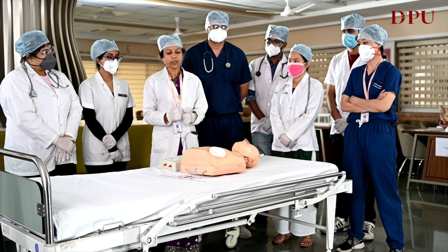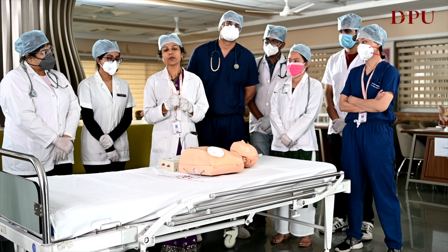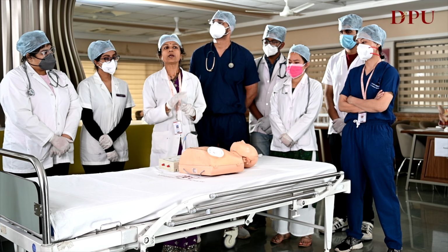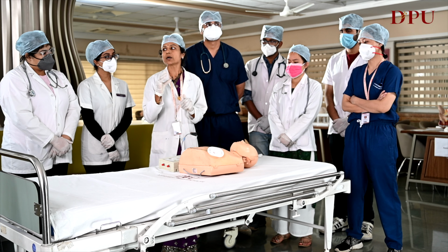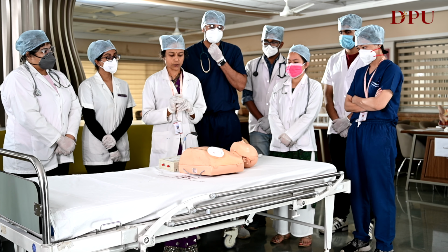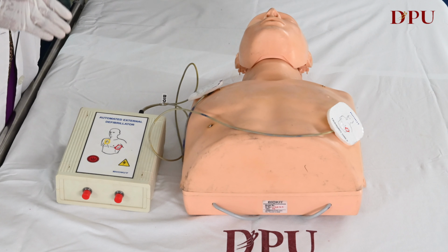So what an automated external defibrillator is doing is giving an electric shock to the heart so that all the electrical activity in the heart muscles is abolished, and if the heart muscles are viable, the heart starts to work again, which is the intrinsic function of the heart. So this is how it works. This is the AED which is available in most public places.